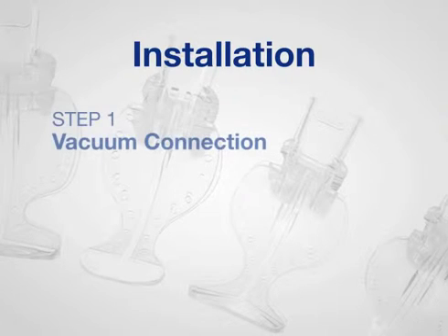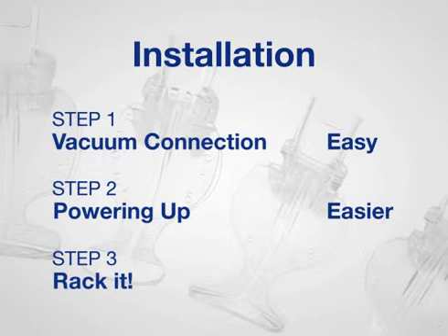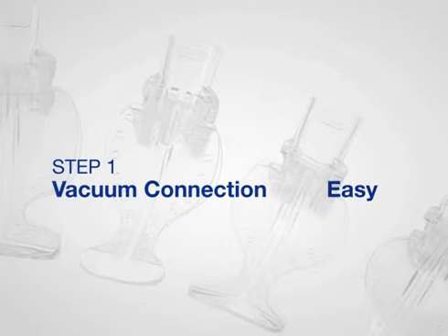We'll break the installation down to three easy steps. Step one: vacuum connection — that's easy. If you have the Isolite, step two is powering up — that's even easier. The last step: rack it — that's the easiest step of all.